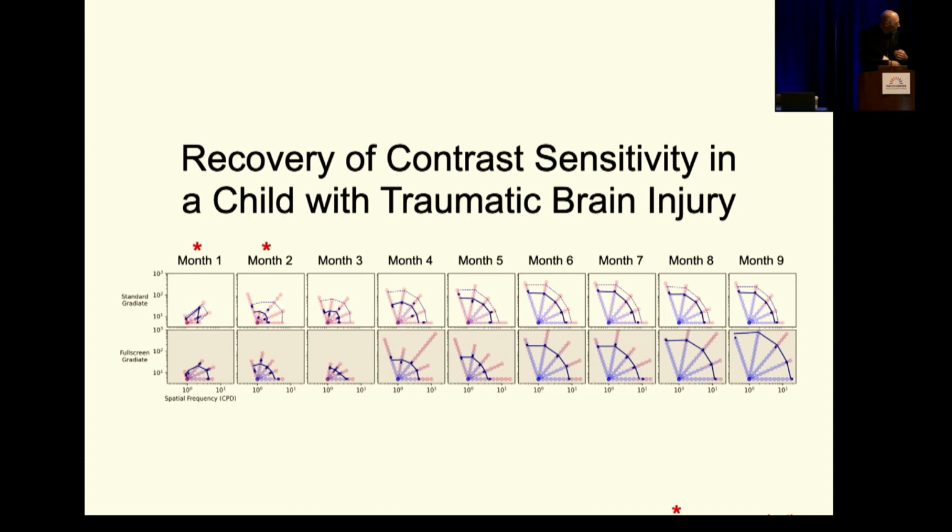They were uncommunicative for 2 months, but still there was enough ability to do this fairly complicated task, if you will. And it just kind of pulls your eye over there when you see movement, and we only need a fraction of a second to get information about how well they do that. And you can see from the outset, even when they're uncommunicative, that they're able to be measured on the full screen or the ball version of this task. And look at the improvement over time.